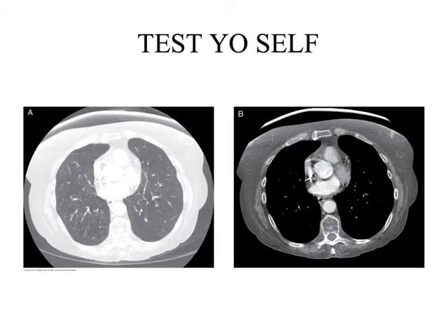Okay, last one. Is this a change in window width or window level? Level. Good, yeah, this is a window level change. So now I've told it so over here I've probably got a negative level, and over here I probably have a positive level.